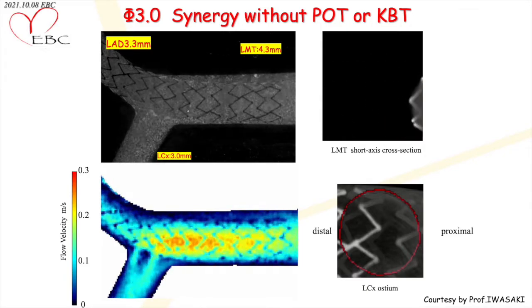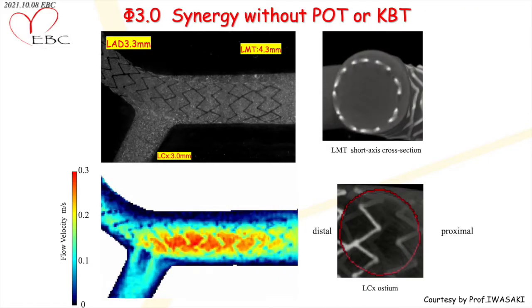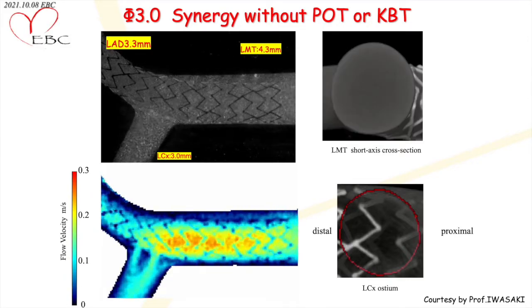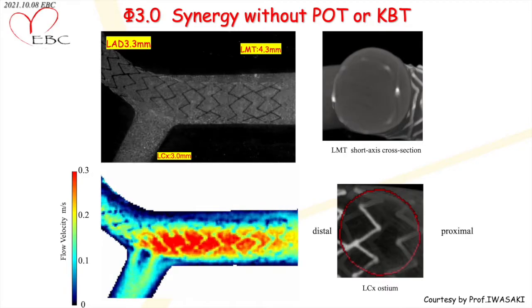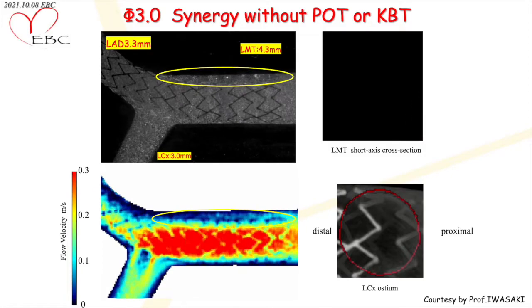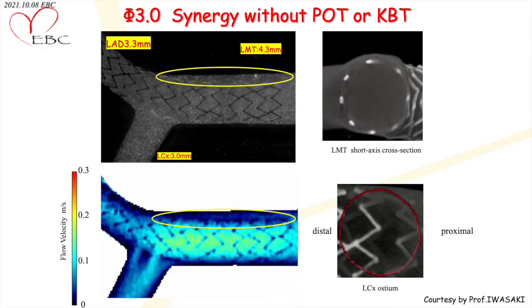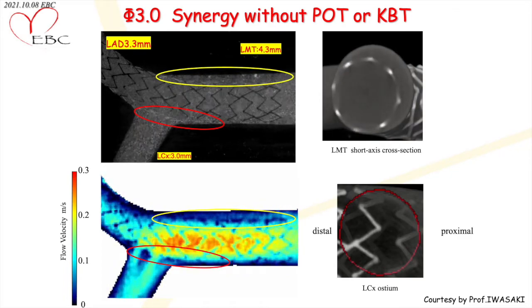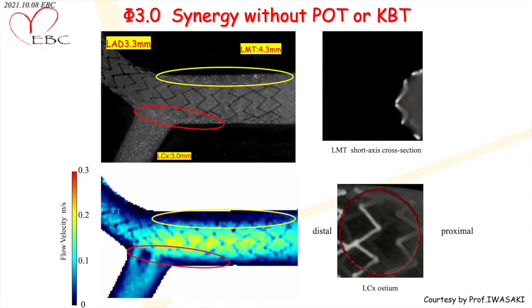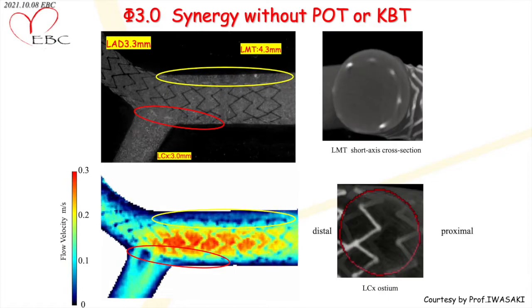If we implant a 3.0 mm stent according to the distal diameter and do not perform POT or KBI, the outer region where the stent strut, surrounded by a yellow circle, causes incomplete apposition, it can be seen that the blood flow dropped extremely. Furthermore, on the jailed circumflex ostium, it is easy to see that blood turbulence and drop are occurring on the back of the strut.